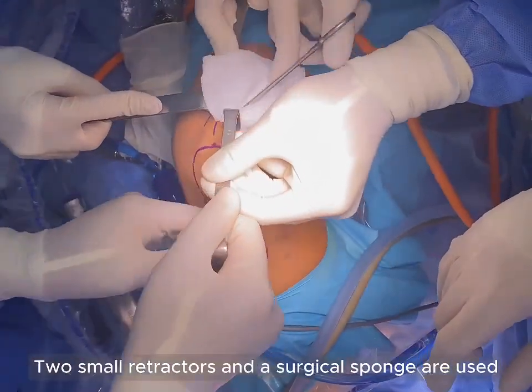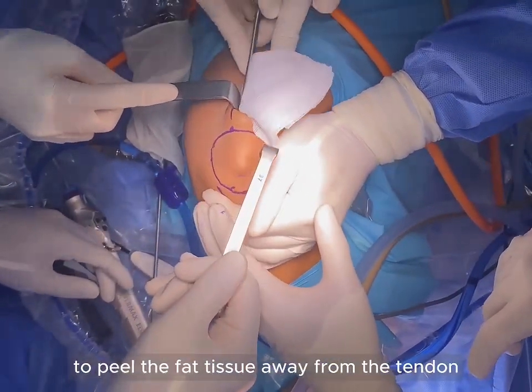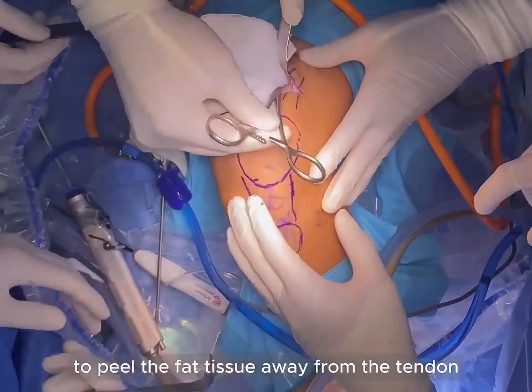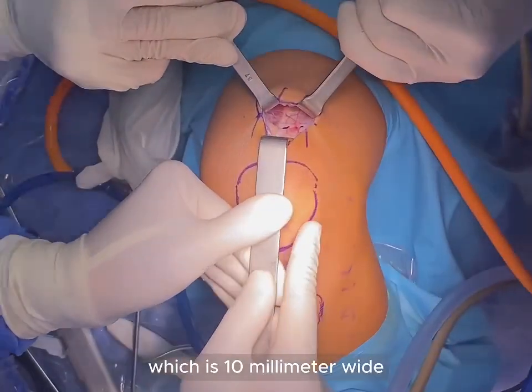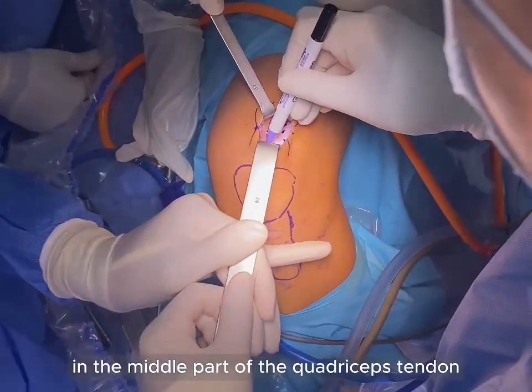Two small retractors and a surgical sponge are used to peel the fascial tissues away from the tendon. Mark the planned graft, which is 10 mm wide, in the middle part of the quadricep tendon.